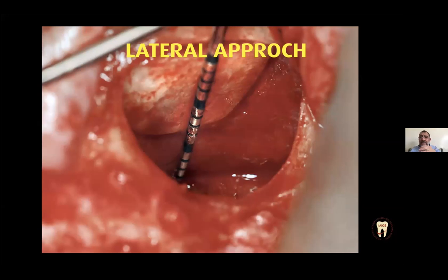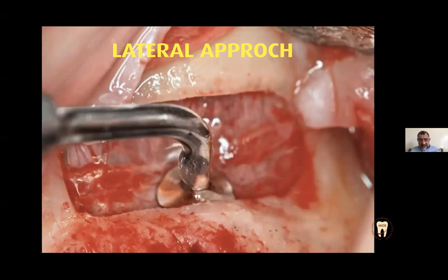You can also remove the bone before filling the sinus, and you can also place this bone into the sinus as scaffolding to protect your membrane from the bone graft. You can use this instrument to elevate your membrane.